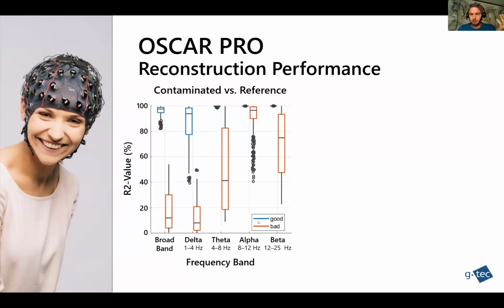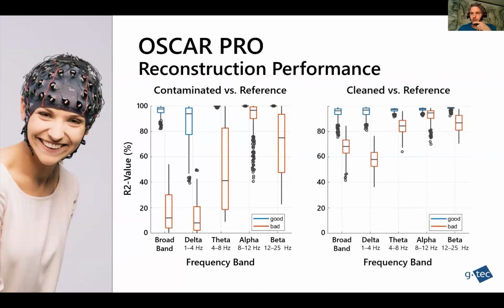And as expected, the artifacts really let the R² value drop a lot, especially in the delta band, the low frequency part, but also tremendously in the theta band and the beta band. Not so much in the alpha band, because in the alpha band, the artifacts were not so present. So that's all expected. Now, when we applied OSCAR PRO, this is what happened. We really improved the similarity, the R² value, for all frequency bands, and also for the overall broadband EEG substantially. So in the end, we can say that large parts of the underlying source signals have been reconstructed, right?